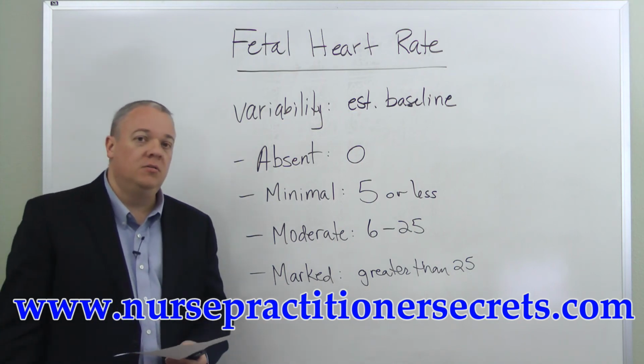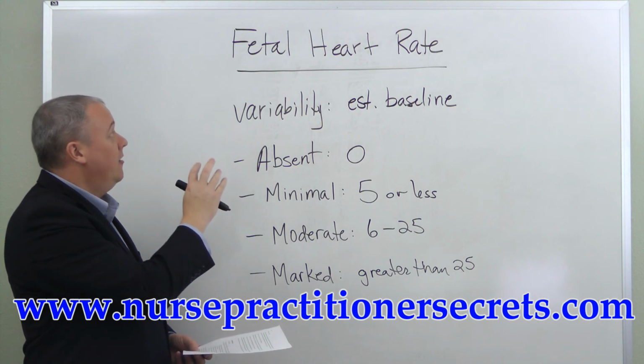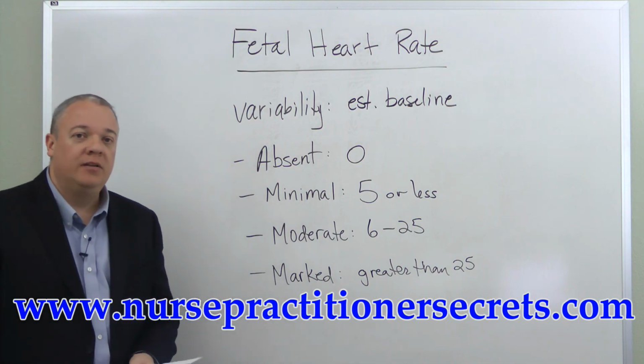It's important that you know this range, this categorization of the fetal heart rate, in order that you might accurately determine the variability and establish the baseline in monitoring fetal heart rates.